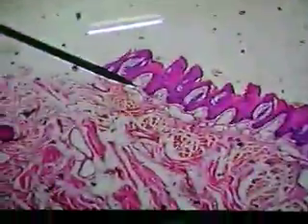Those are the fungiform. Alright? Underlying, also in the lamina propria, and underlying this will be some glands. There are glands in the anterior 2/3 of the tongue and glands in the posterior third.